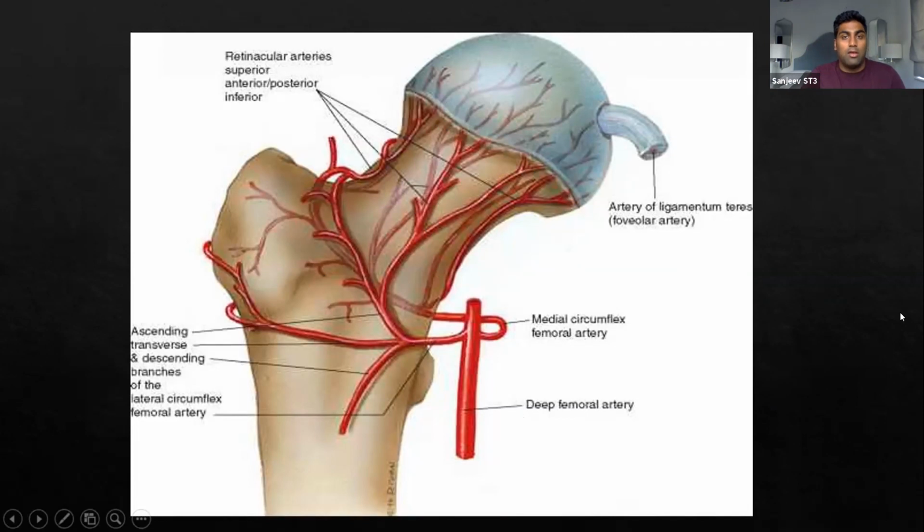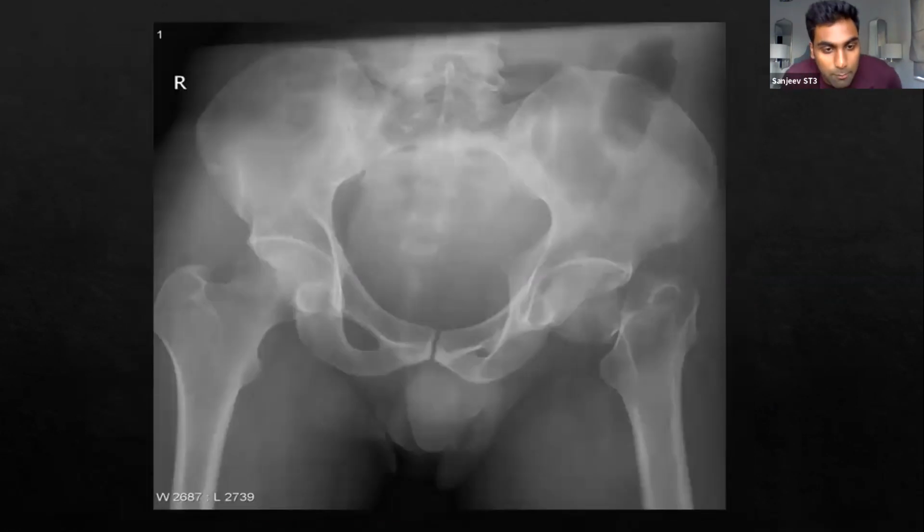Okay, so I have 2 cases here. Would anyone like to present this one? Just 2 more, guys, I promise. We'll be done. You've been very patient. I want to get as many people involved as possible so you can go away thinking you've got something out of this session as well.